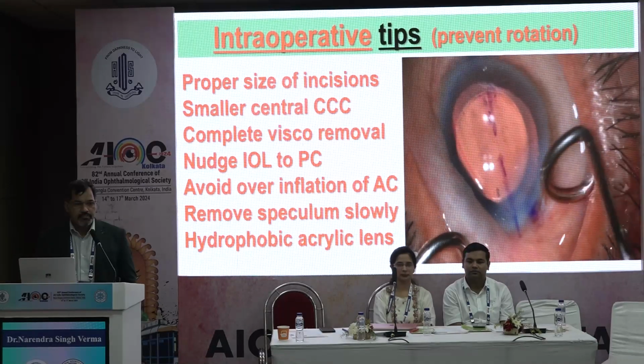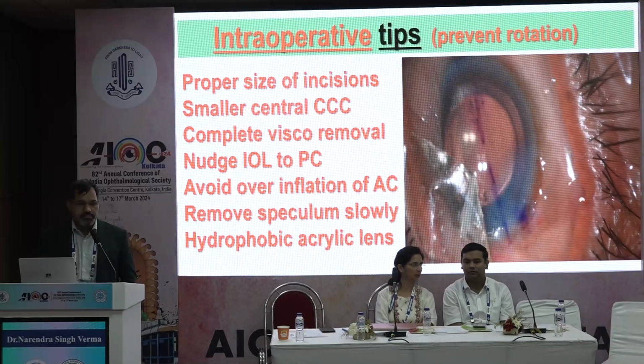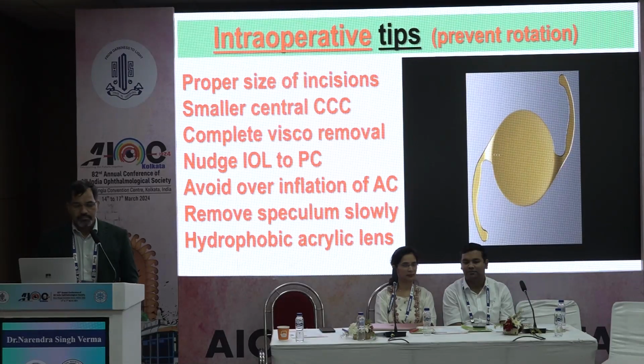Remove the speculum slowly. There should be no pressure on the globe while removing the speculum. Patch the eye for 2-3 hours. Use a hydrophobic acrylic lens as it has a high adhesive property.